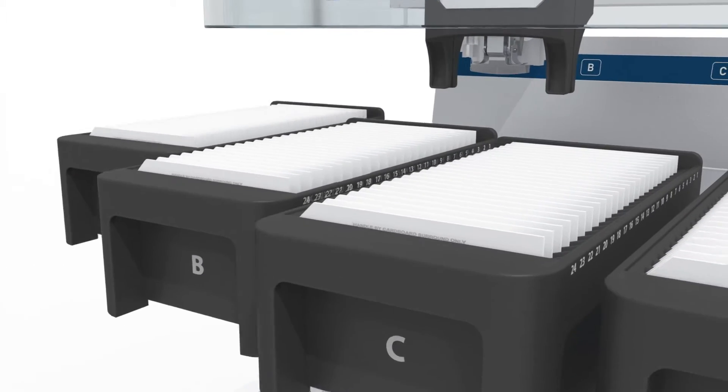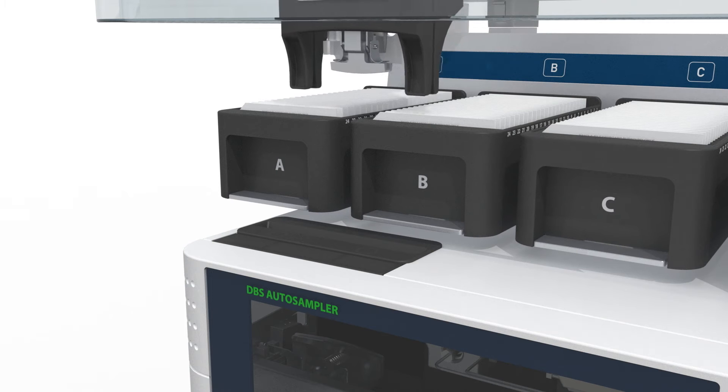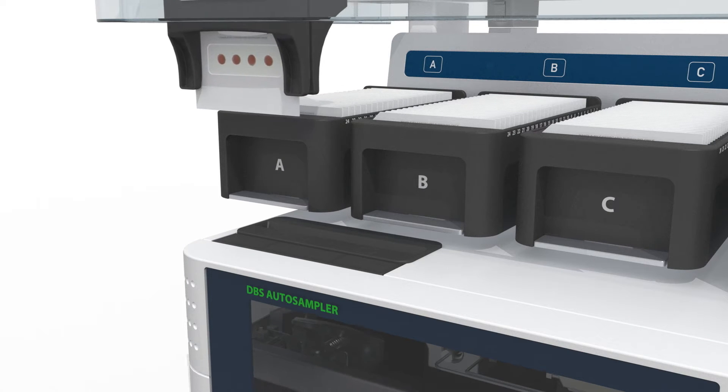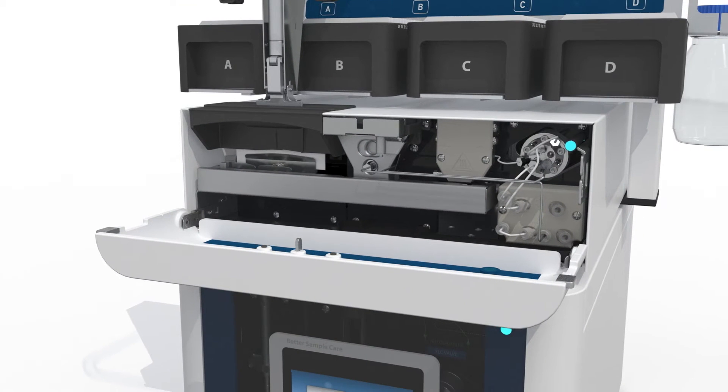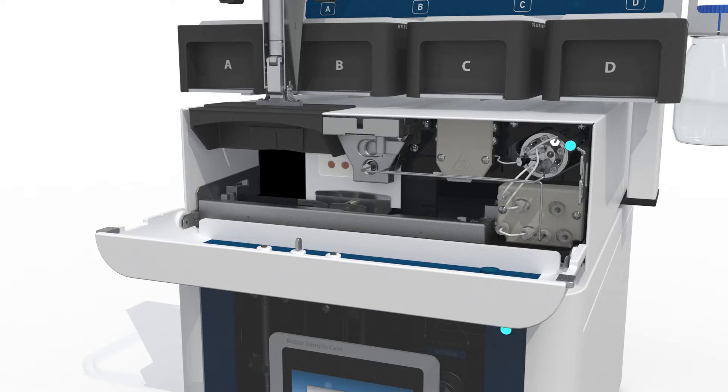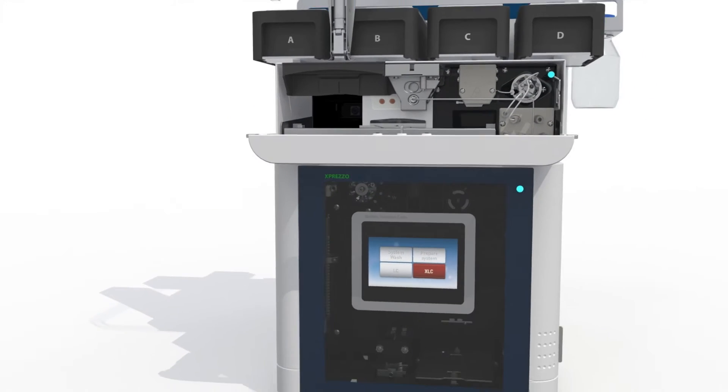A card-handling robot with expandable capacity, ranging up to several hundred cards, picks up a card from the tray, placing it in front of the camera via the entrance slot. The camera reads the barcode and locates the spot center for adequate positioning of the spot into the desorption clamp.